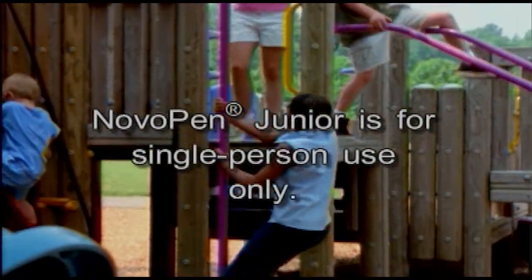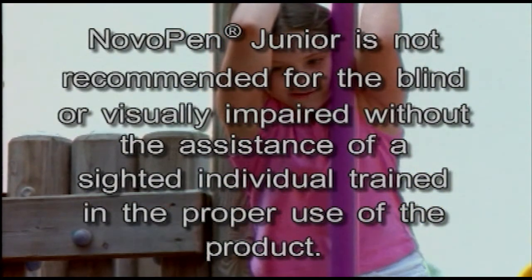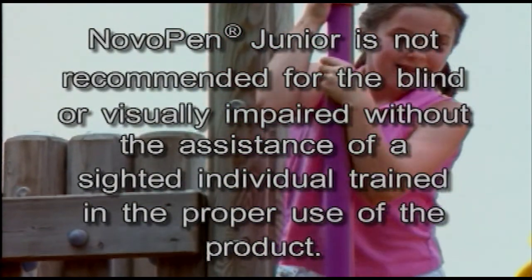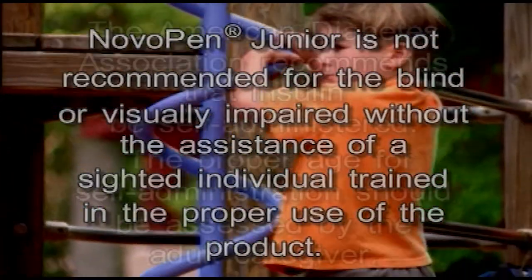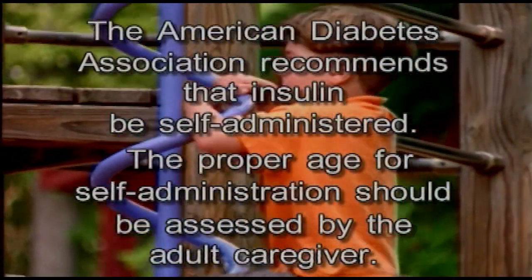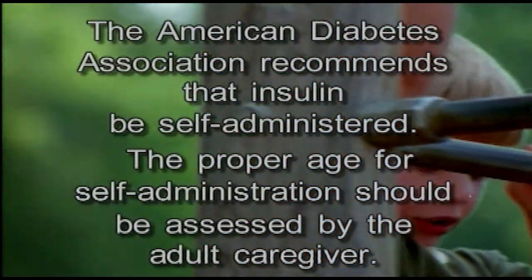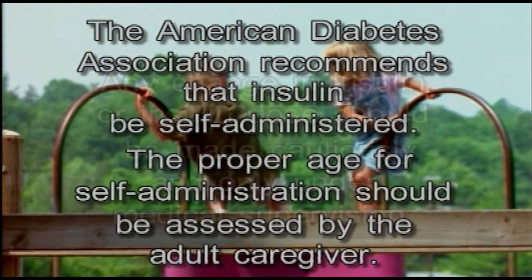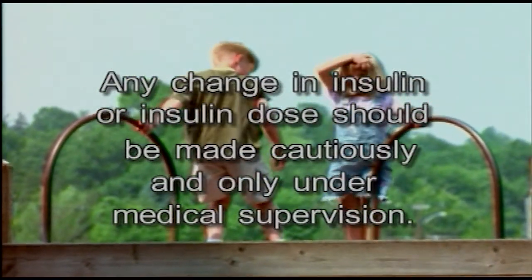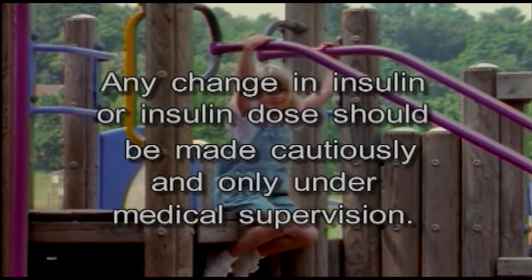NovoPen Jr. is for single-person use only. NovoPen Jr. is not recommended for the blind or visually impaired without the assistance of a sighted individual trained in the proper use of the product. The American Diabetes Association recommends that insulin be self-administered; the proper age for self-administration should be assessed by the adult caregiver. Any change in insulin or insulin dose should be made cautiously and only under medical supervision.